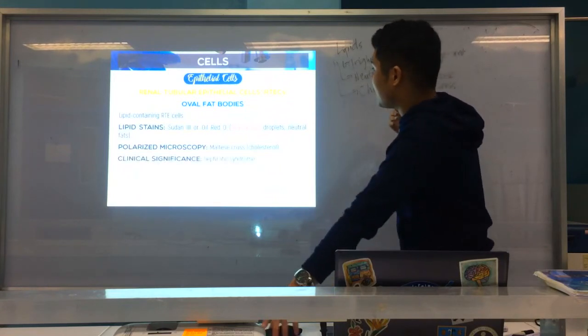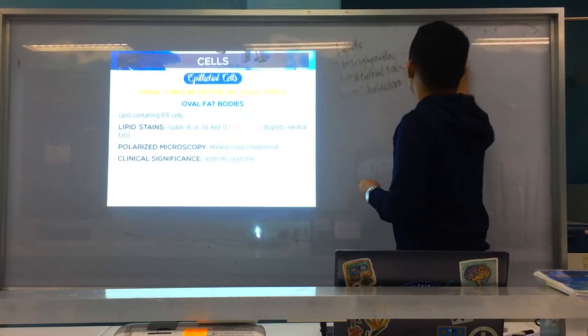So, clinical significance: where do we see oval fat bodies? Usually in nephrotic syndrome.